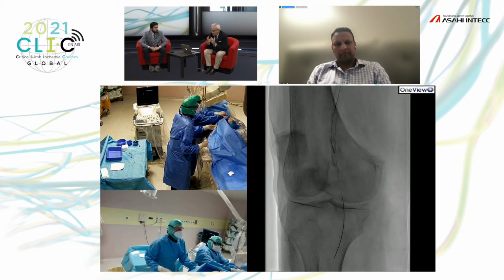So the feeling was that it is a resistant wire.